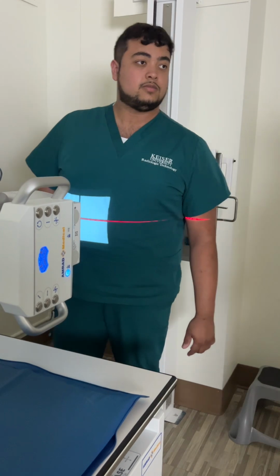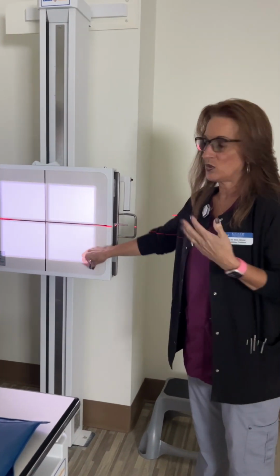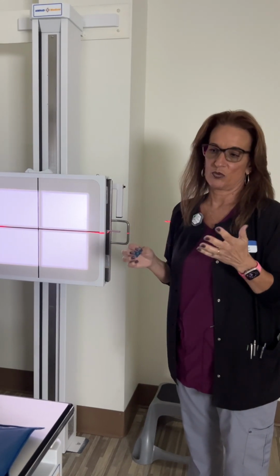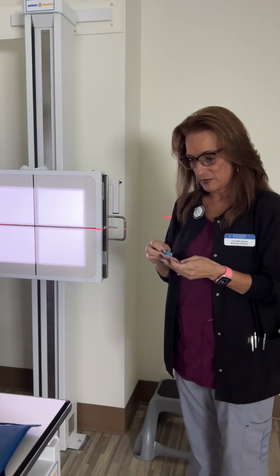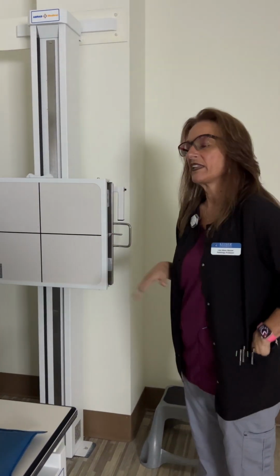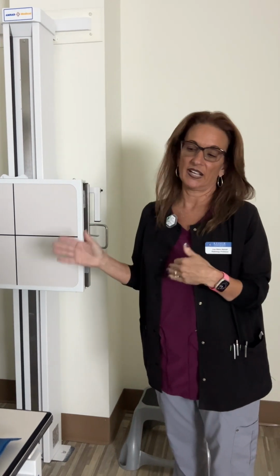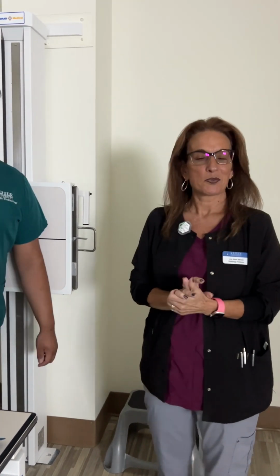Now, it's not common that you just do an upright abdomen, so most likely this would go in conjunction with a supine abdomen, and we did already demonstrate the supine abdomen, so this is just the upright one view. And then when I'm done with everything, I would take my patient back and let him change. And that's an upright crosswise abdomen.